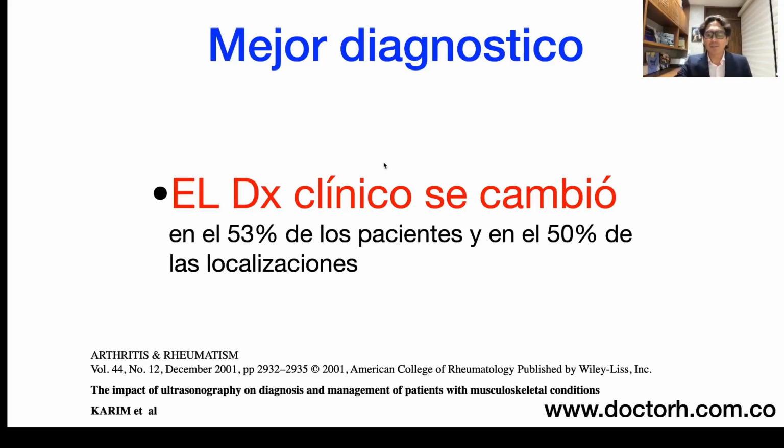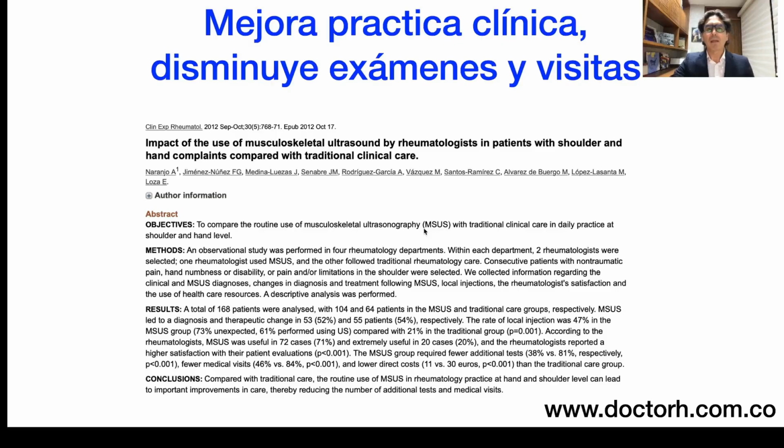In our practice, we use it all the time in the office, because in more than 50% of cases, we change the diagnosis when we use ultrasound, and even within a segment, we sometimes change the location of the diagnosis. This is something that, once you start doing it routinely, you'll realize that this percentage is real, and it's supported by the literature.